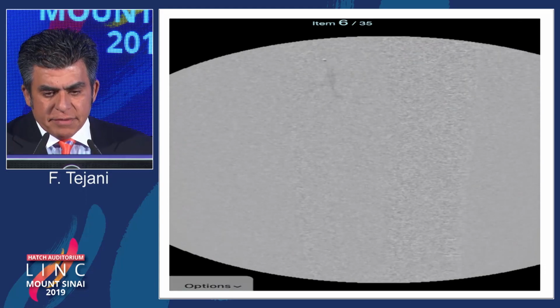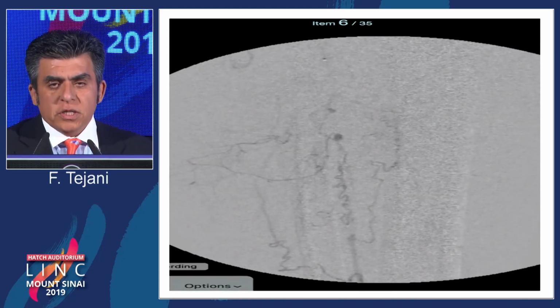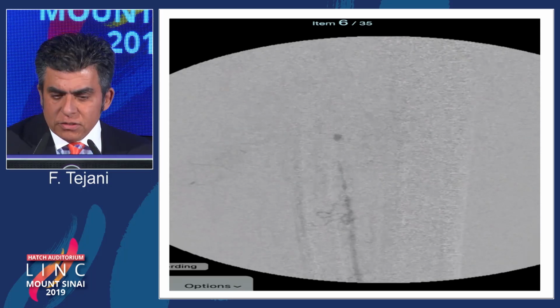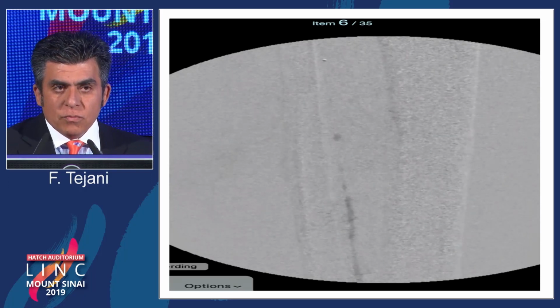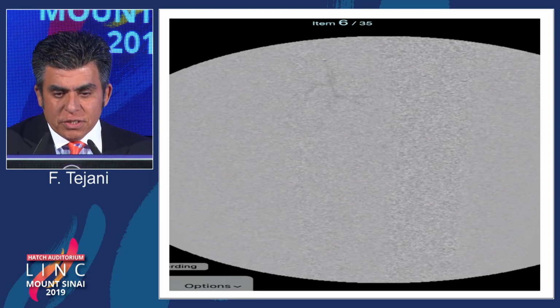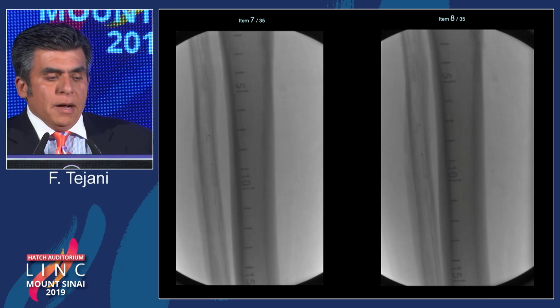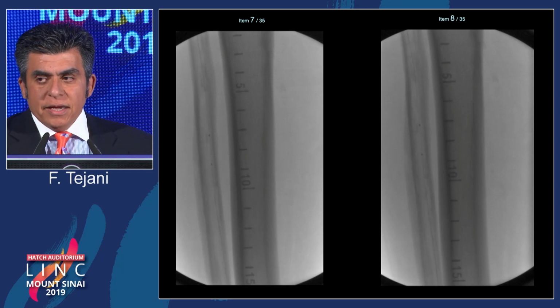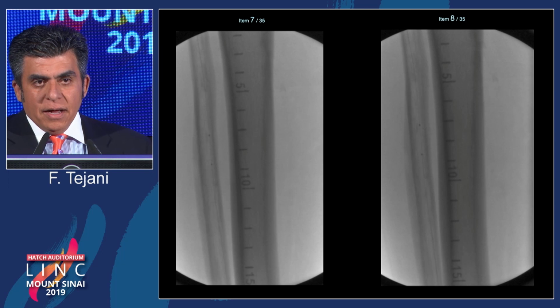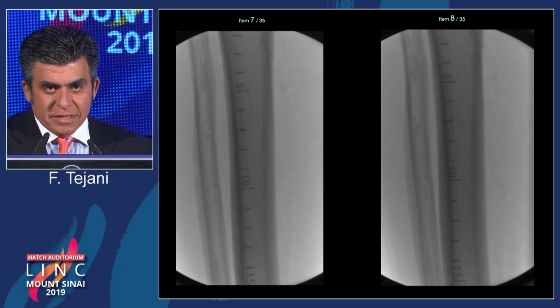Selective angiography from the catheter, which was a 0.014 system, showed a long total occlusion of this vessel. So at this point in time, the decision was made to at least give her 1 vessel revascularization here. And we got lucky insofar as the wiring, catheterization, ballooning, and atherectomizing her.